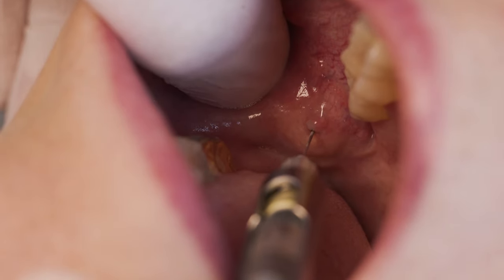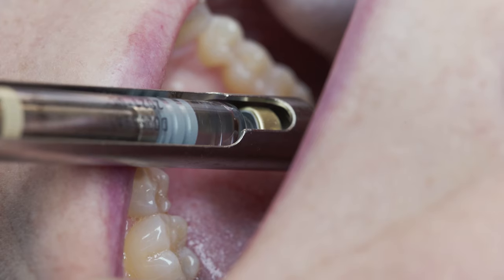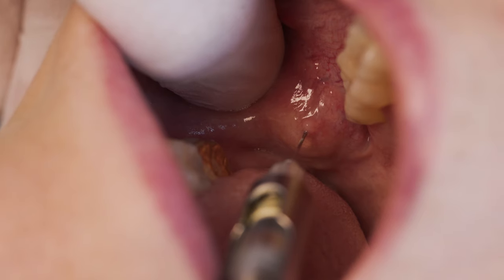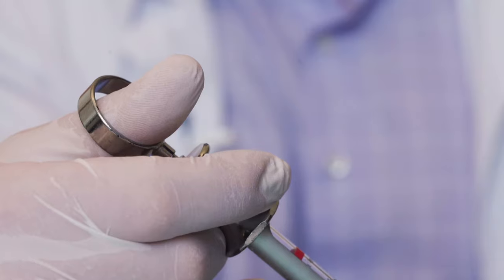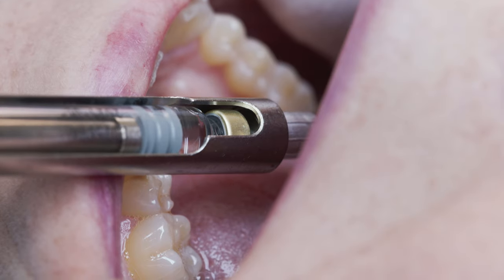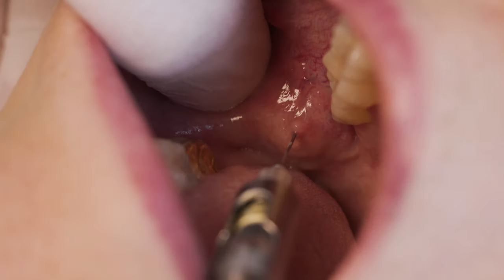We still need to deal with the lingual nerve. Withdraw the syringe partially until approximately half of it remains within the tissue, and aspirate again. If aspiration is negative, deposit the remaining solution.